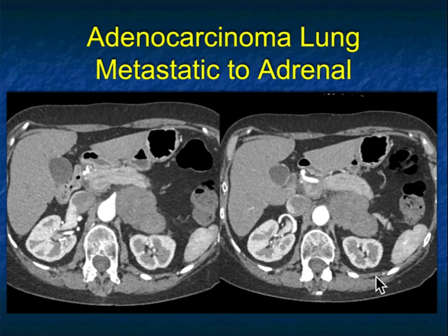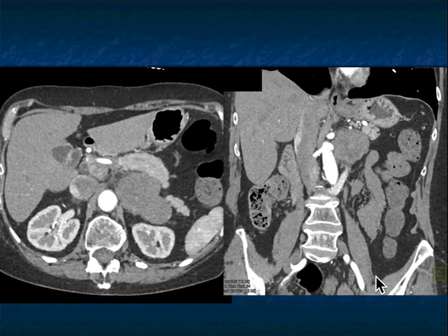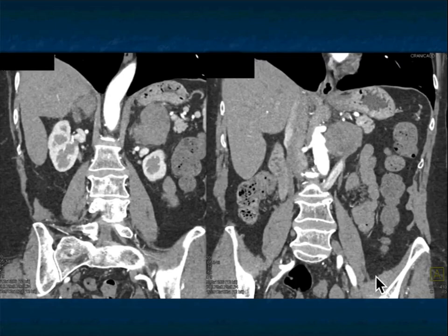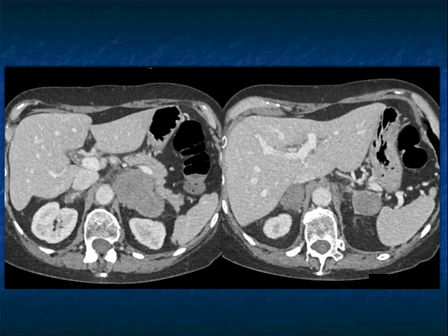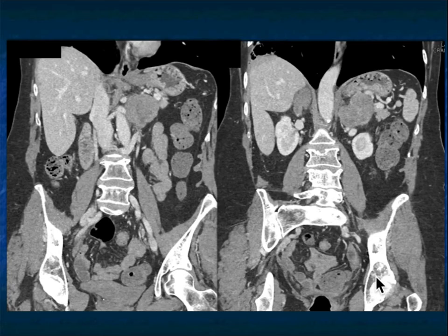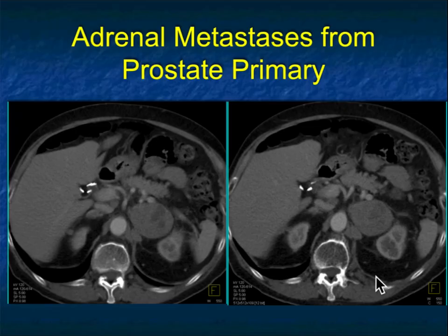Another example: lung cancer adenocarcinoma metastatic to the left adrenal gland — a large solid mass, very nicely seen abutting the aorta. Here it is on the coronal perspective. Another example of bilateral lesions, right and left, with the left being larger. It's typical for one to be larger than the other. With hypovascular lesions, picking a primary is difficult.